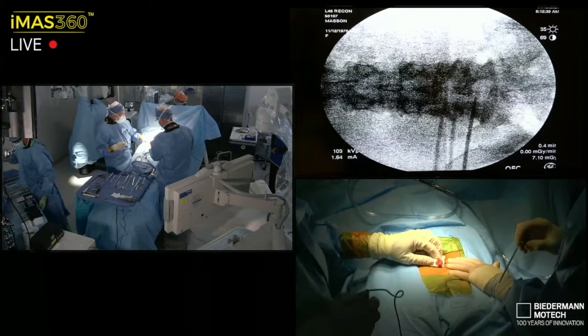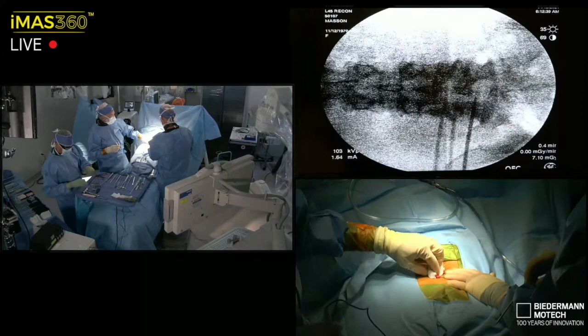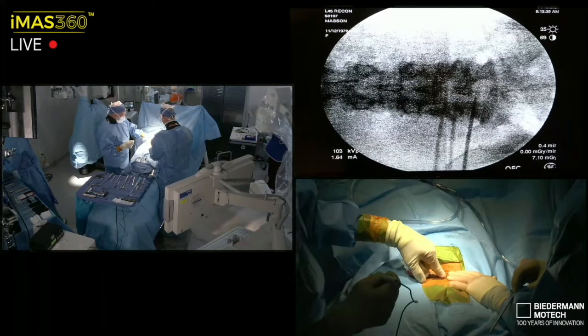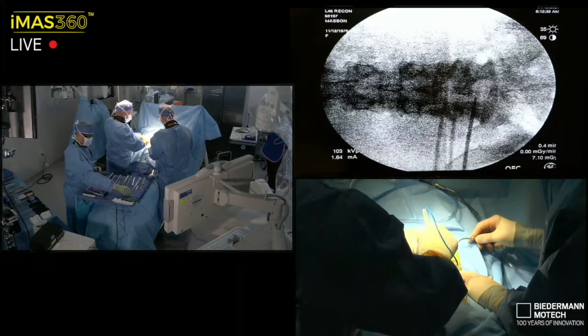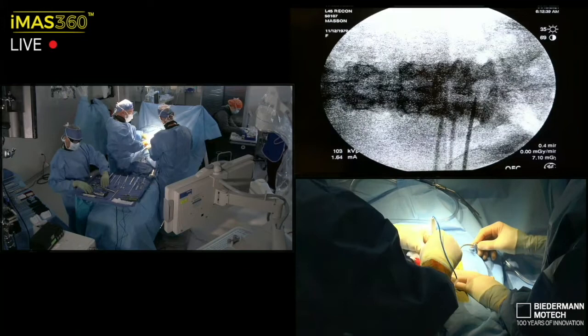Yeah, so from here, my finger is going to basically be right on the dorsal spinous process, which in all my decompressions, I preserve the dorsal interspinous zone. I'm not going to have a big laminectomy defect. On the other hand, I'm going to have a very focused laminotomy defect that we have to protect as we dive down blind. So my finger's going to be just in the dimple to offset right transfascial and left transfascial. And right is going to be virginal because we didn't do any right muscle manipulation. We did everything from an internal lamina perspective from the left. So that'll be a fresh plane on the right.